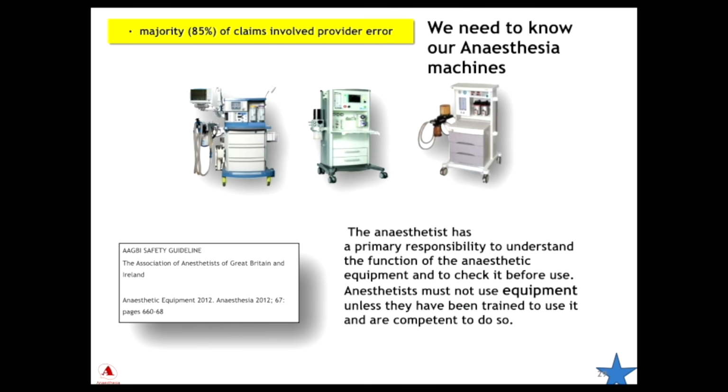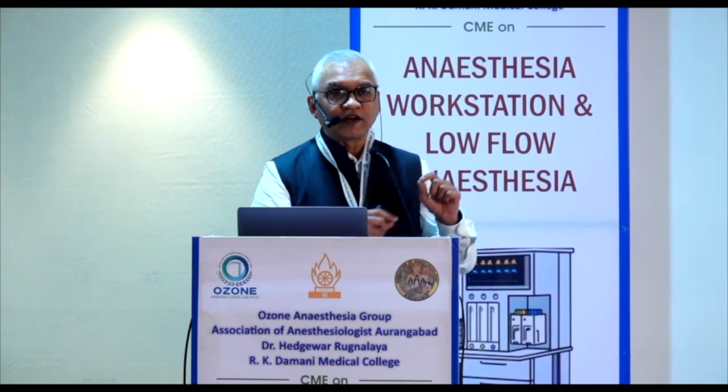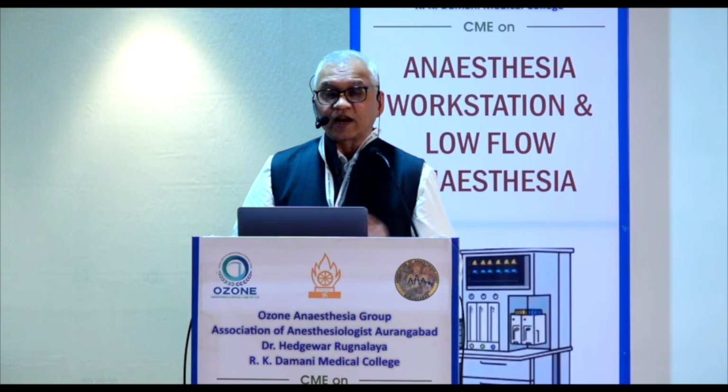The AAGBI safety guideline has identified that it is the anesthetist's primary responsibility to understand the function of anesthetic equipment, check it before use, and must not use equipment unless they have been trained to use it, okay, and are competent to do so.